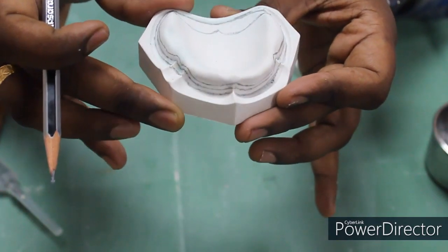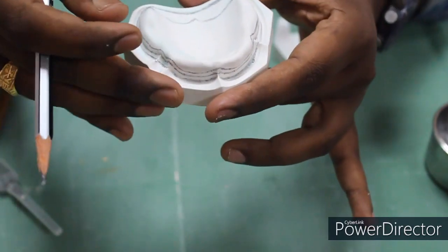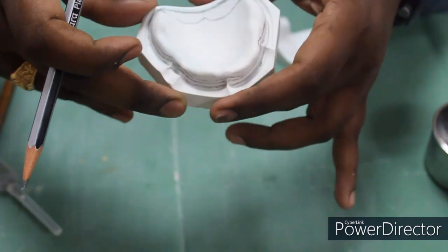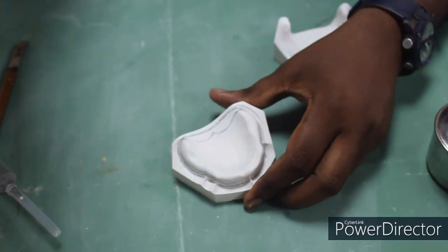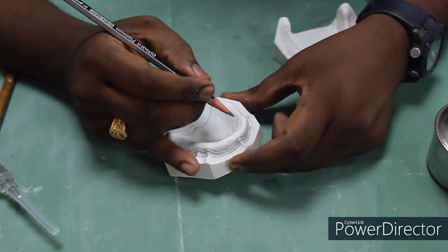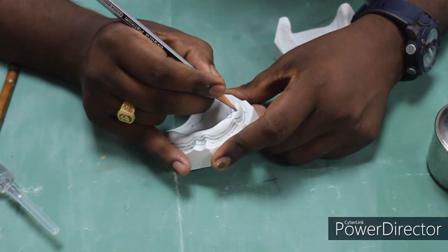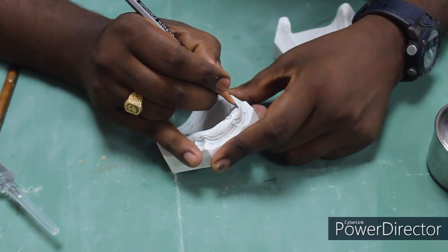In addition to this, we are using the stopper in this design. Why? To provide extra support for the tray and prevent vertical displacement of the tray during impression making. So I will be drawing this stopper in the canine region bilaterally, using the CPC, that is, the incisive papilla canine prominence. With this reference you can locate the canine region.